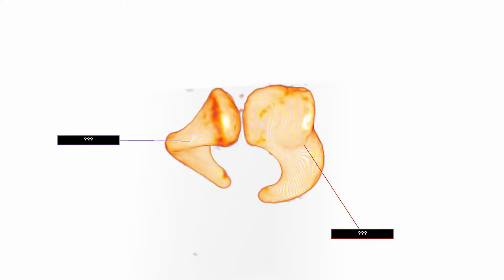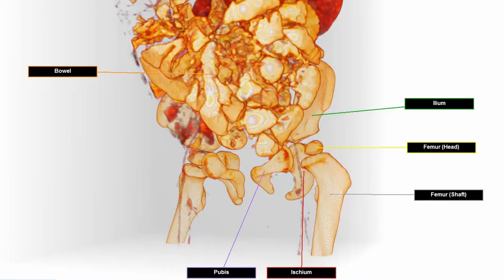I'm going to release the clipping planes now to reveal the rest of the volume. As we can see, these two bones are the pubis and ischium, or two of the three bones that form the pelvis in a two-year-old male patient.